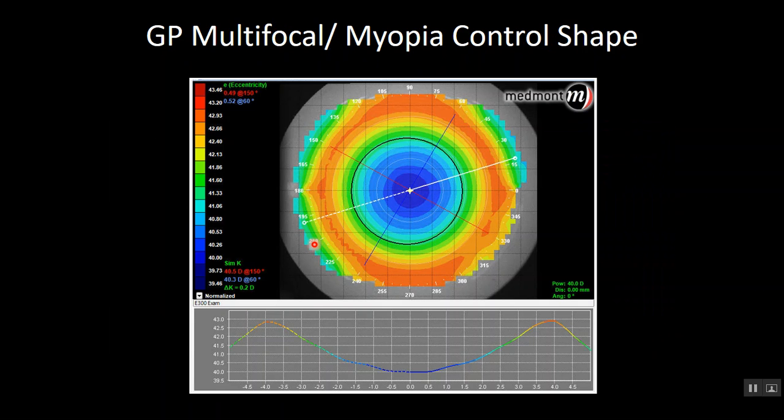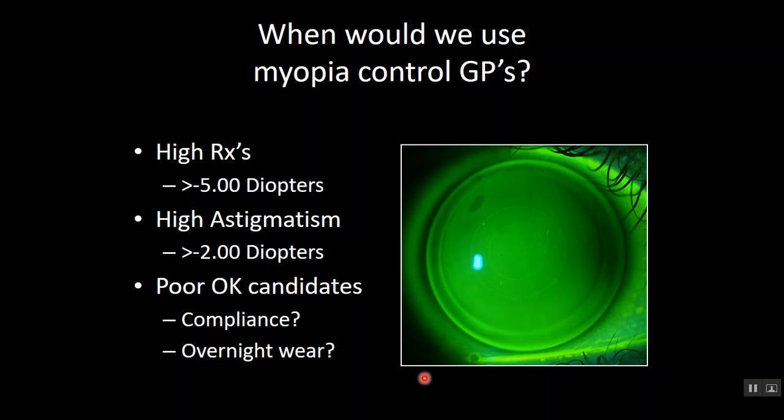So as an example, here we see a pupil of approximately 5 millimeters, and our most minus in the center, most plus toward the periphery. So this is a map over the anterior surface of a multifocal rigid lens. In fact, an Apex multifocal from Precision and Cardinal.